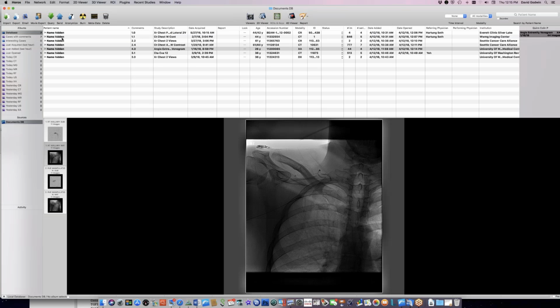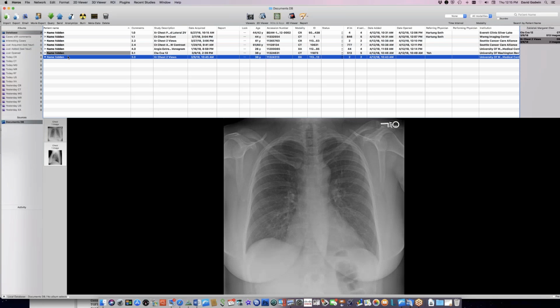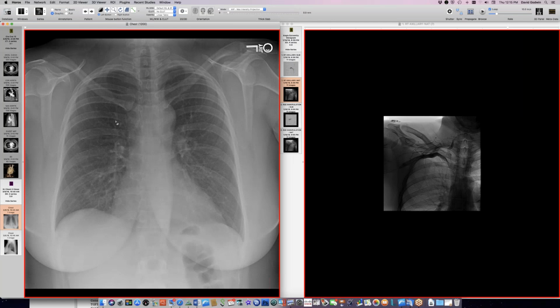So there was one other case I wanted to show you guys. Let's see. I think I showed you that one. Okay, let me show you this one.